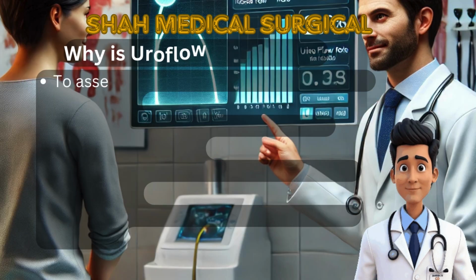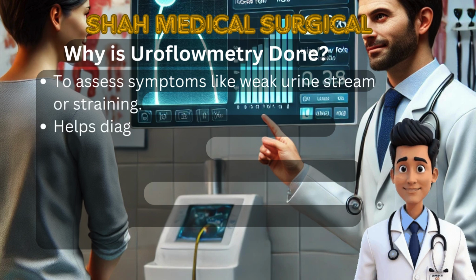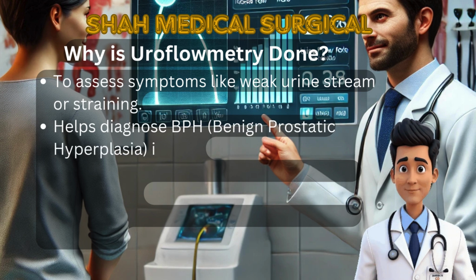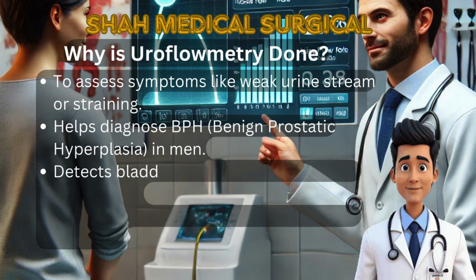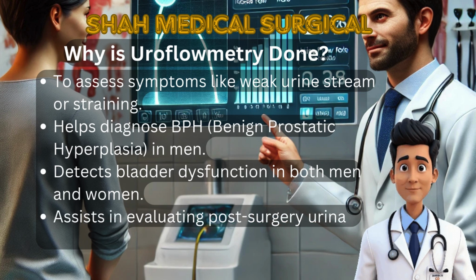Why is uroflowmetry done? This test is performed to assess symptoms like weak urine stream or difficulty urinating. It helps diagnose benign prostatic hyperplasia, BPH, a common prostate issue in men. Bladder dysfunctions in both men and women can also be detected through uroflowmetry. Additionally, it helps monitor post-surgery recovery after urinary treatments.